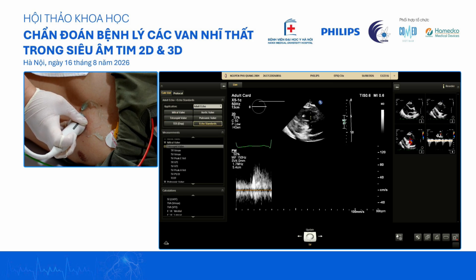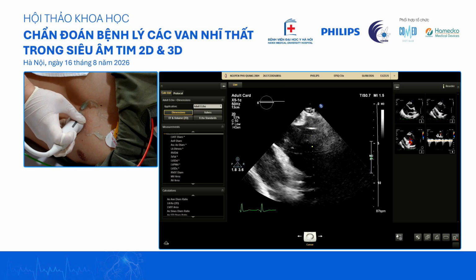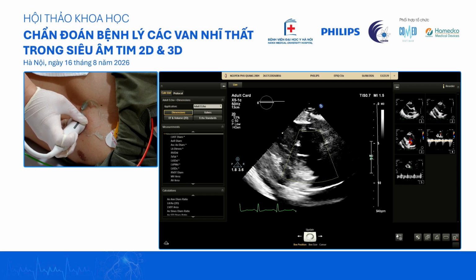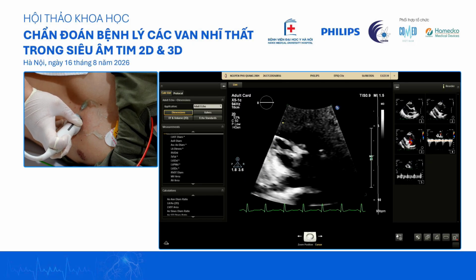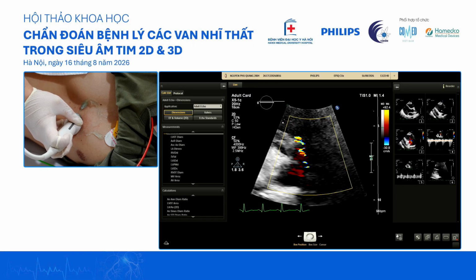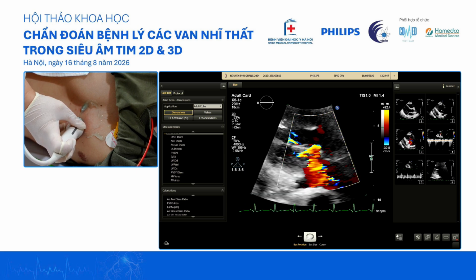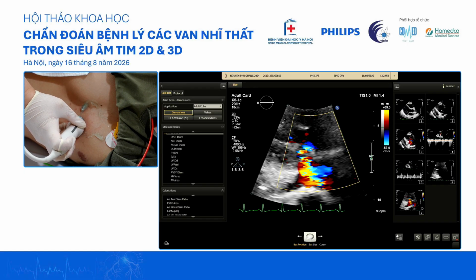We'll also just take a pulse wave just to look at the inflow. Đánh giá pulse siêu âm Doppler xung qua đường vào thất phải. We can also zoom in onto the valve. Look at the structure, zoom vào để đánh giá cấu trúc. Color, and we can do a PISA. Đánh giá PISA. So actually we can see some PISA head over there. Chúng ta có thể thấy cầu hội tụ.